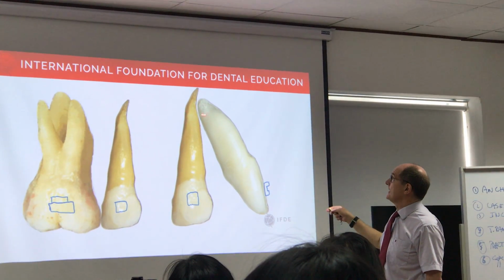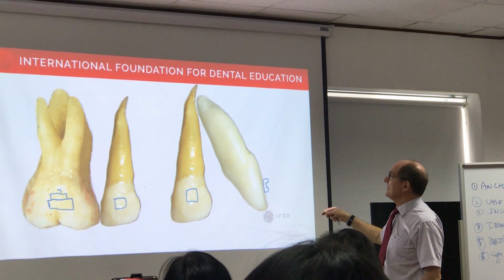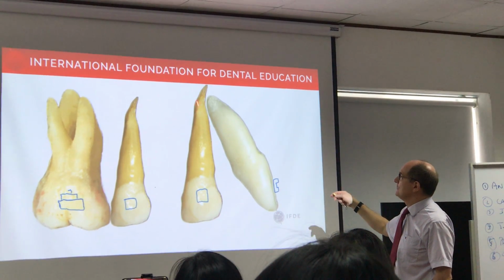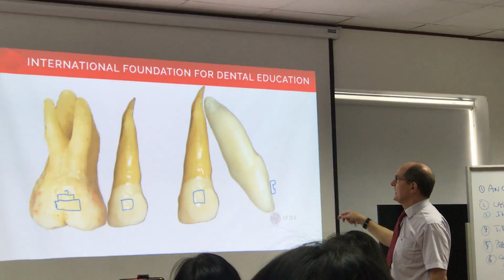Because it's going to tell me how close are these roots, but it's also going to tell me which direction do I have to move this root so that I'm not hitting the other tooth roots in order to bring it in.